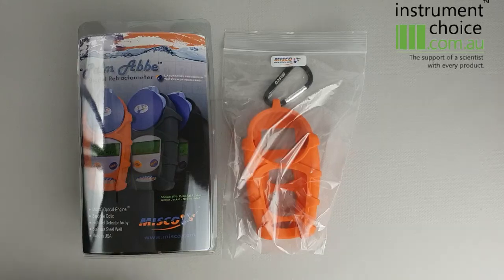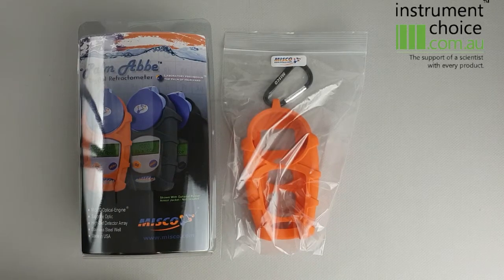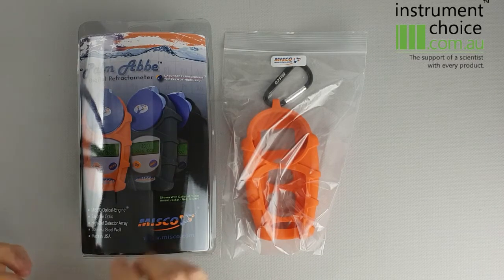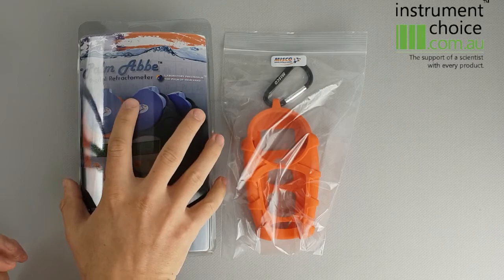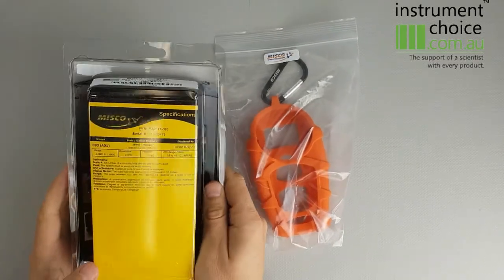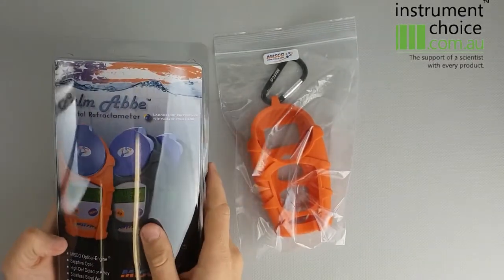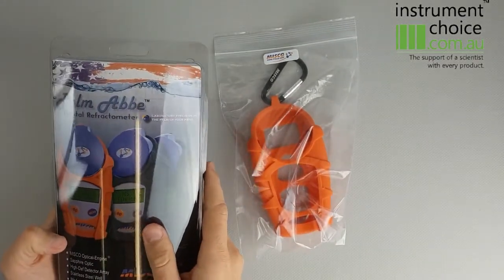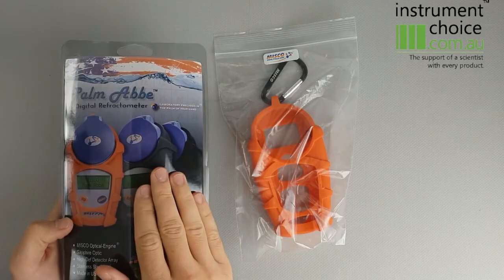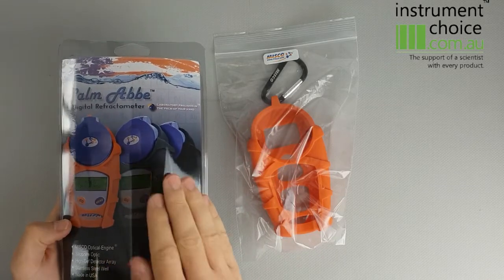Good afternoon guys, it's Daniel from Instrument Choice going over the MISCO Palm AV digital refractometer for urine today. As you can see, this comes in fairly simple packaging. This is a US-made unit.